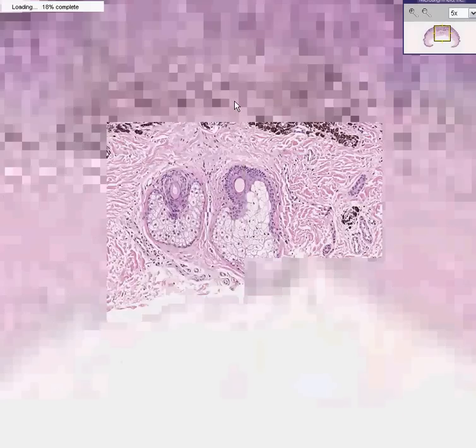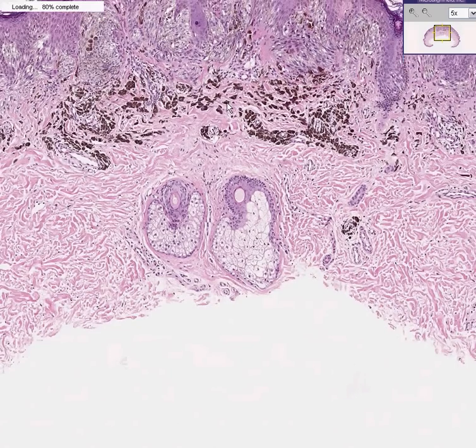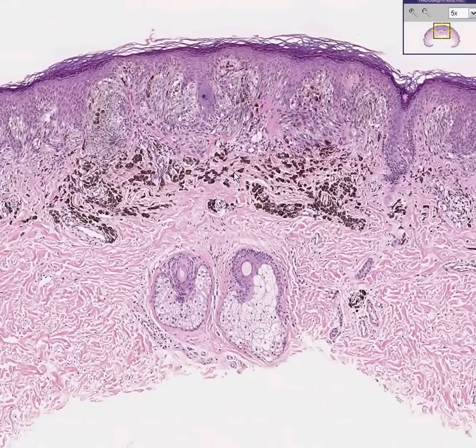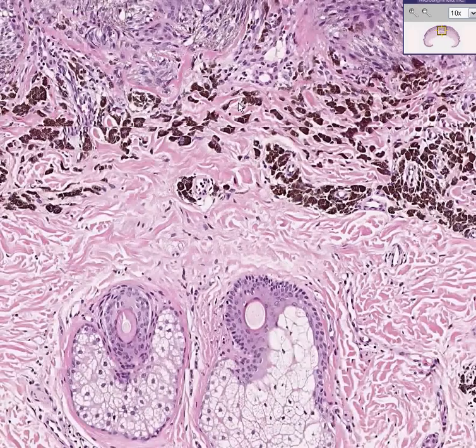We know already that this is some type of melanocytic tumor. Melanocytic tumors are by definition called nevi, which is the plural of nevus. Sometimes melanocytic tumors, when they are abundantly pigmented, they look like this. Sometimes when melanocytes are not pigmented, they may look like this.